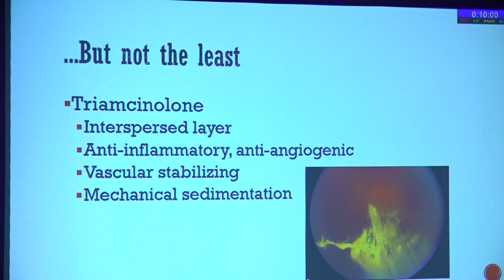So the retina many times, which is atrophic, once you're trying to remove this clot, it will give way and create iatrogenic breaks. So this triamcinolone layer in between can act like a barrier between the two. It also gives you anti-inflammatory and anti-angiogenic benefits. It stabilizes the vessels and creates mechanical sedimentation of a little bit of RBCs that are left in the cavity.